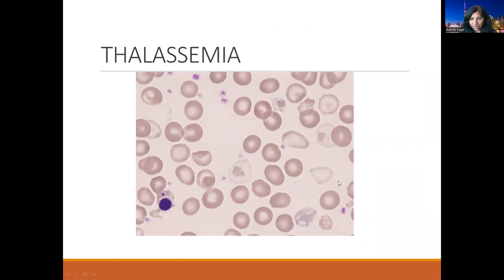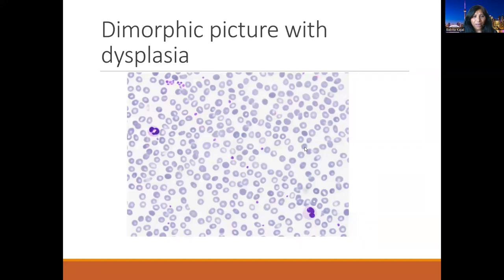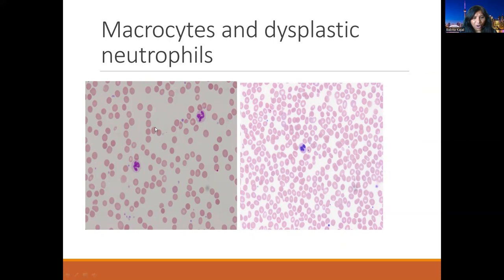This is a typical picture of thalassemia — quite large nucleated RBCs with a hypochromic picture in the background. This is a dimorphic picture with normal cells and hypochromic cells, and in the background we have dysplastic neutrophils. Here, this neutrophil has only two lobes with very few granules — it is hypogranular — and the nuclear shape is almost ring-shaped. The macrocytic cells along with a neutrophil that is hypogranular, combined with cytopenia and dysplastic neutrophils, is probably indicating MDS.